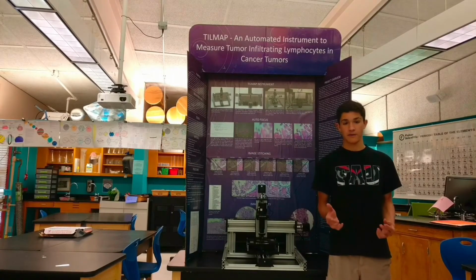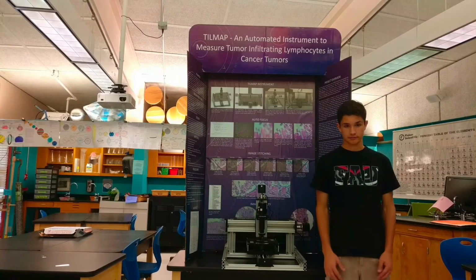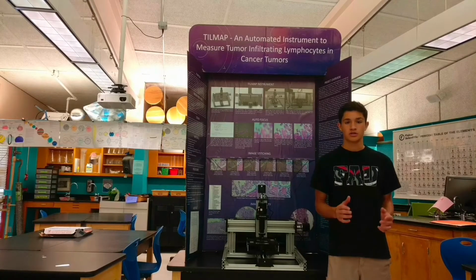This process is time and labor intensive, requiring highly skilled doctors who have been trained to recognize cell patterns as it relates to cancer. A recent study showed that pathologists, when reviewing the same slides, will agree on the diagnosis only 75% of the time, which can dramatically impact treatment and outcomes.